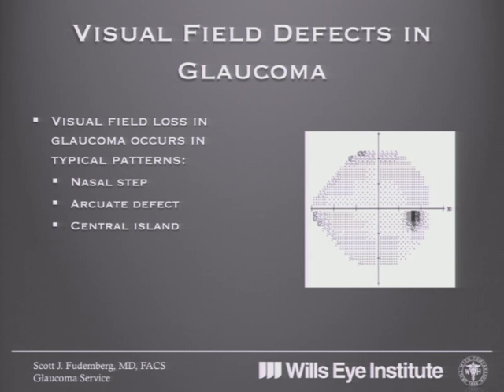And you'll notice that most of it is white, but that there's a black spot. And that black spot is your normal blind spot. The reason you have a blind spot is that's the area where the optic nerve enters the back of the eye. And there are none of those cones and rods, none of those photoreceptors in the optic nerve to help you see. They're all located in the retina. So there's a little area of blindness which is reflected by dark colors in the visual field that's structurally related to the position of your optic nerve.